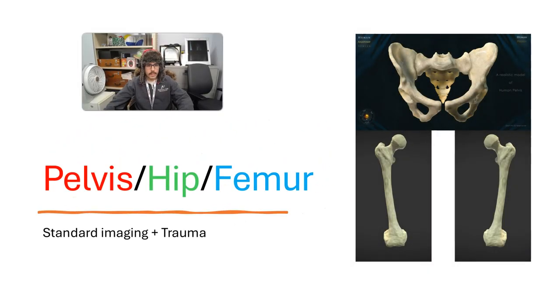Alright guys, let's get into pelvis, hip, and femur. I'm going to go over standard imaging, trauma imaging, especially this time of year. You're going to see a lot of people coming in a lot of pain, and you're going to have to know how to get good images while also keeping these patients stable. So let's get into it.